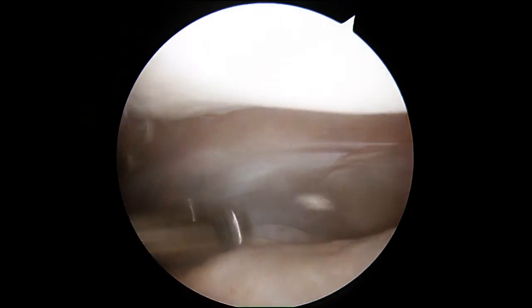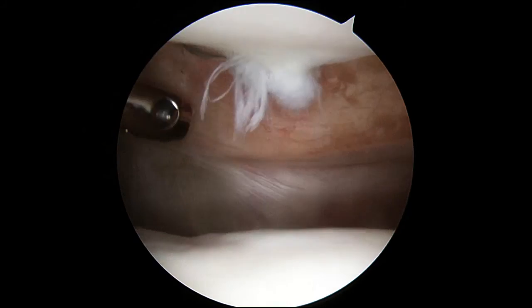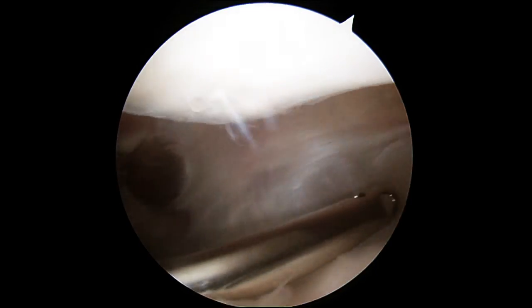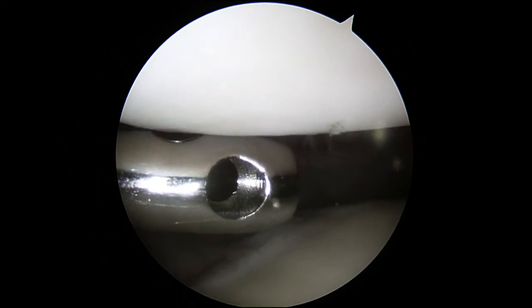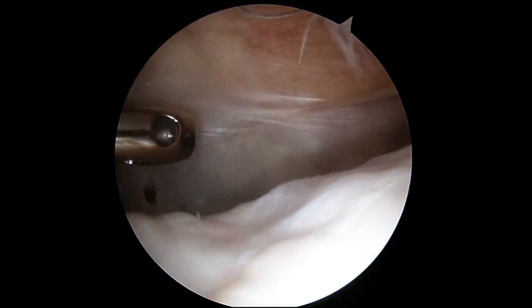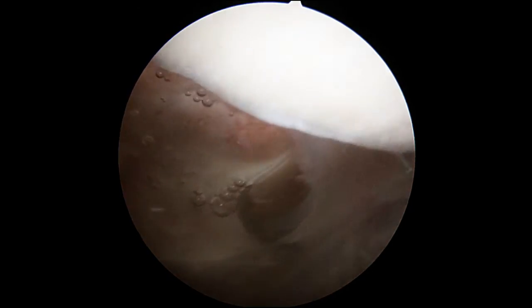That weight above is your kneecap or patella. There's a little bit of frayed cartilage there — it's pretty minor, not a big deal, I'll clean that up. And there's the outside, the lateral part of your patella. Your MRI seemed to show it looked a little worse than that, so that's good news — the kneecap doesn't look quite as bad as I thought.